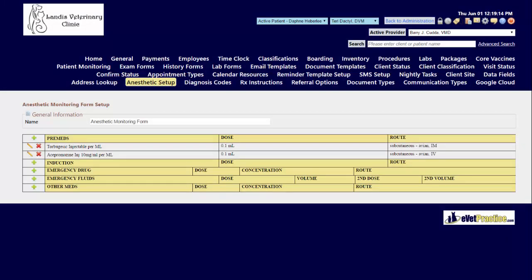Emergency drug, emergency fluids, and other meds allow you to enter the default concentrations as well. That way if you need to use these drugs quickly you already have the doses correctly calculated.